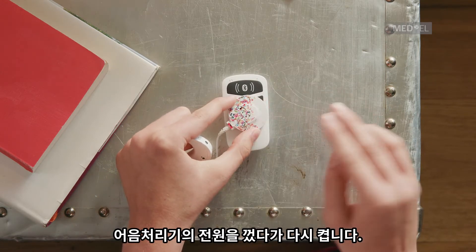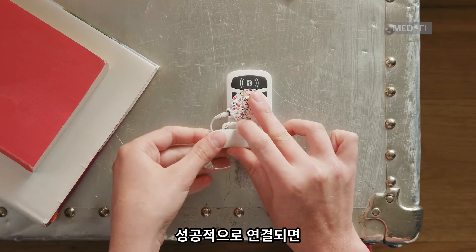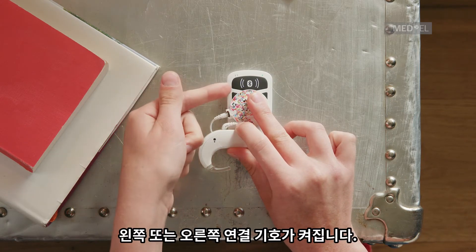Switch off the processor and then back on. When it's successfully paired, the left and right connection symbols will light up.